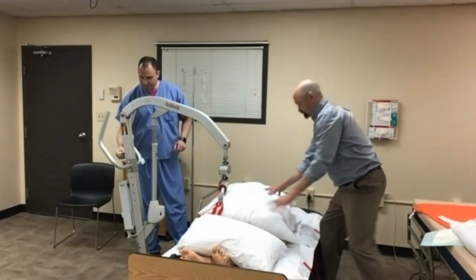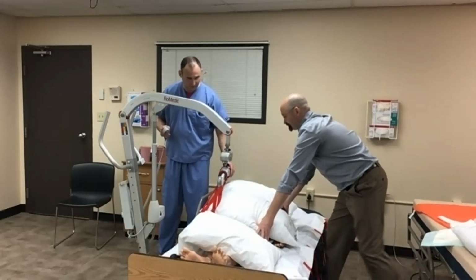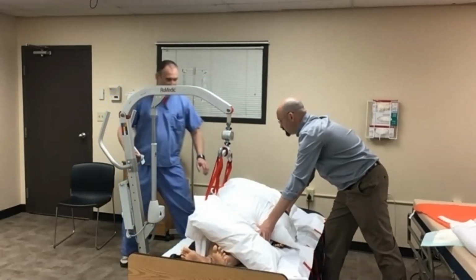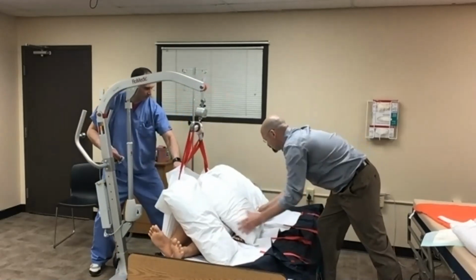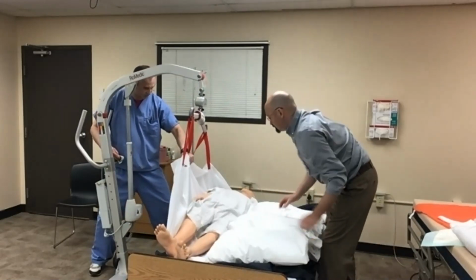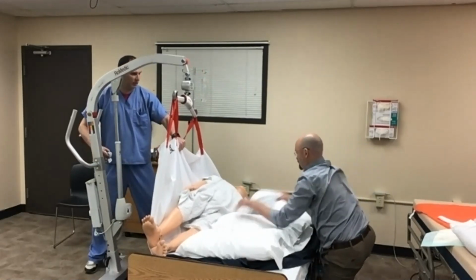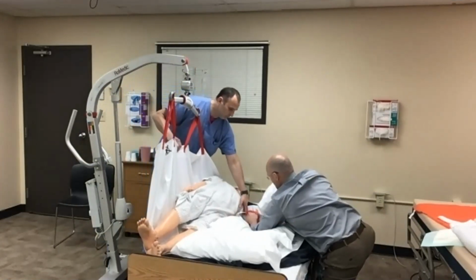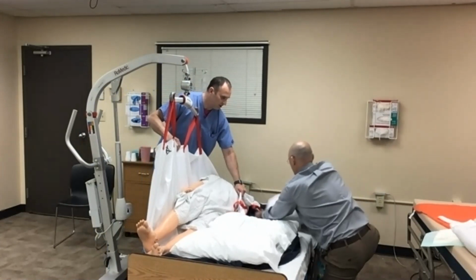Ready? Ready? Start to lift. As I'm lifting, I'm making sure I've got good tension here. Brakes are off on the lift so it can adjust itself. I'm not exerting force. The slide sheet did that for me, just so you know. Now we're going to stop here so that we don't get the patient prone too early. Chris is going to tuck those underneath the sheet. Actually, I'm going to go under the slide sheet, yep.